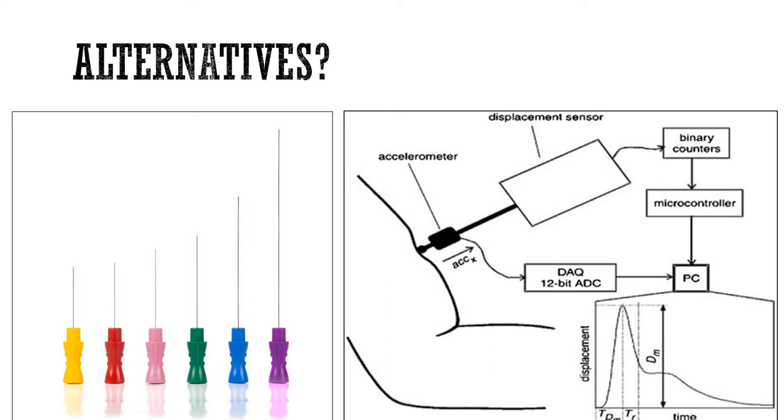around too much anyway. It's mainly used in clinical settings to assess the progression of conditions like ALS or motor unit diseases, there are several actually, and assess the progression of those conditions. It doesn't generally get used in sport and exercise science for reasons we've covered, but it does overcome the issue of only being able to assess superficial muscles.